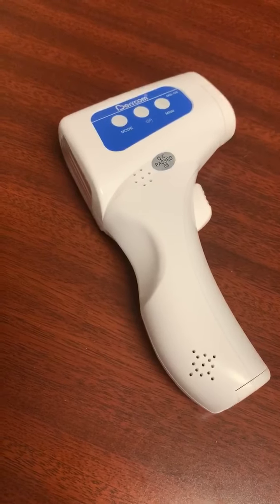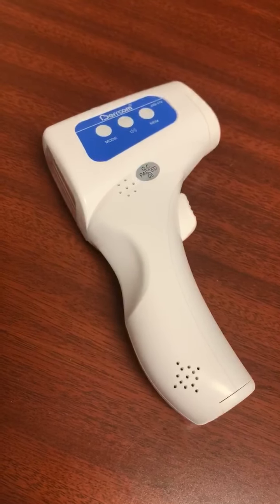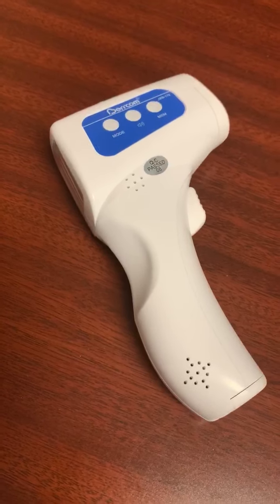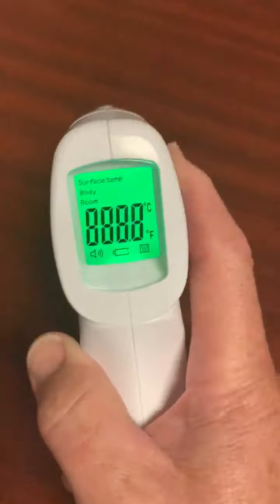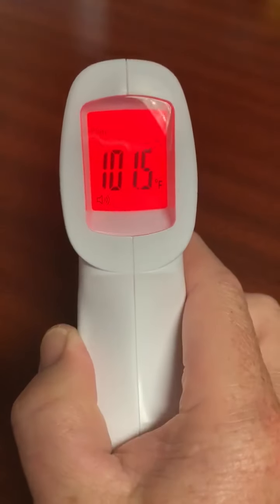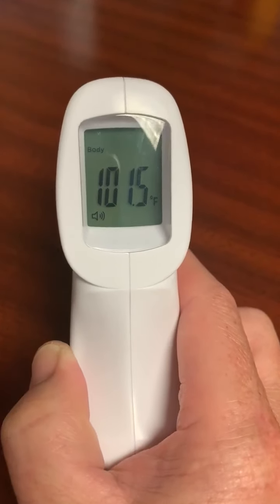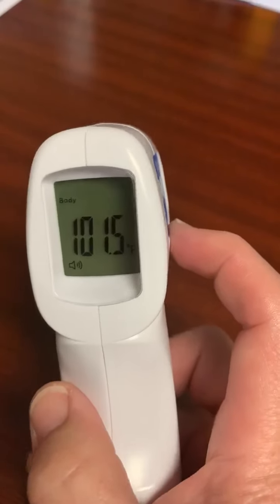This video is meant to show you how to check and possibly recalibrate your JXB178 non-contact thermometer. Let's start by turning the thermometer on. I'm going to take a quick temperature — my temperature has registered at 101.5. That seems unreasonably high for me, so I'm going to check the calibration.